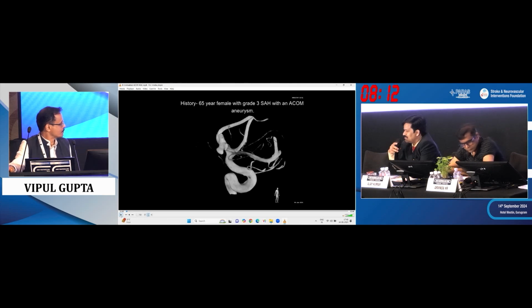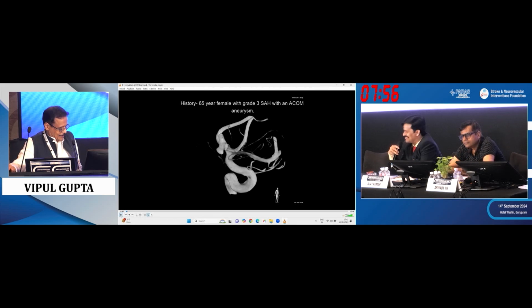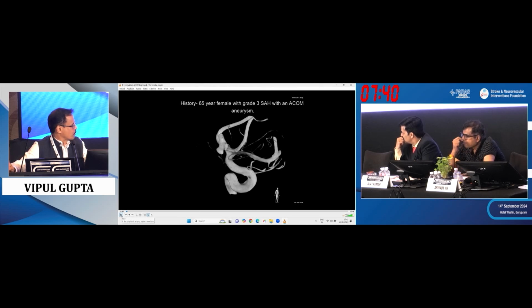Yeah. So in this case, the magic was not only the balloon, but the different shapes and yogasana of your microcatheter, different yogasana, I'm saying, different shapes. Yes. So that was impressive. Those, as you say, hyper shapes. Yeah, I just wanted to show a lot of youngsters that balloon coiling is good, but we have to shape the micro. We need not catheterize with the wire in acutely ruptured small aneurysms, and with multiple shapes we can catheterize them.